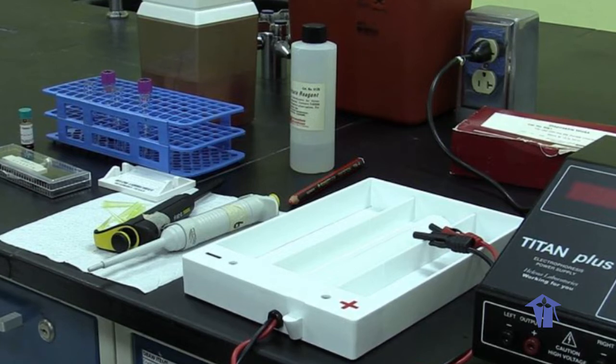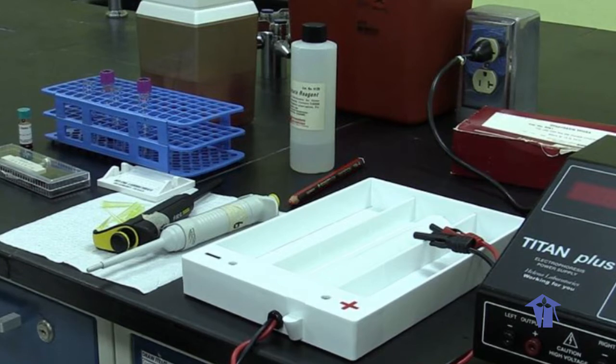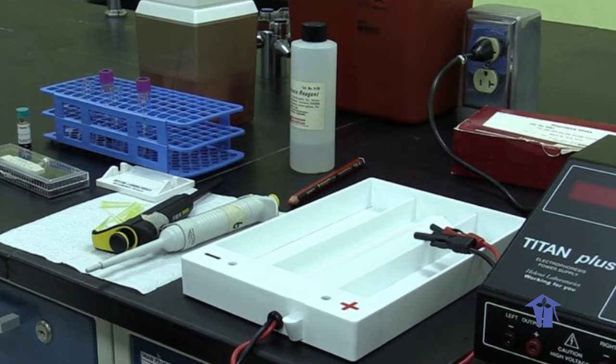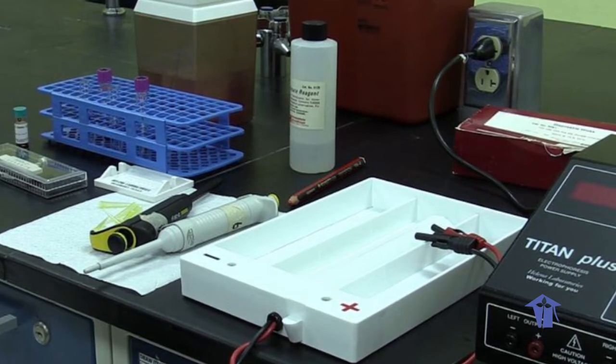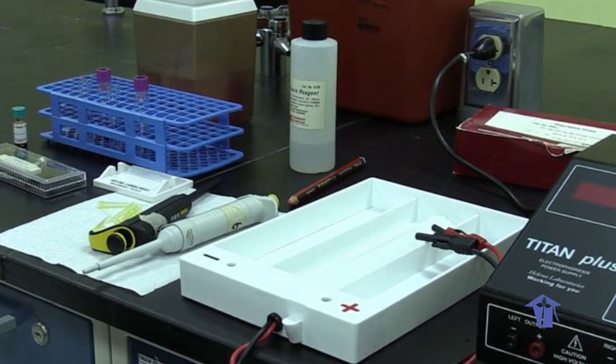And the principle of this electrophoresis is that hemoglobin at an alkaline pH is negatively charged when it is subjected to electrophoresis, and therefore it will migrate from the cathode to the anode.